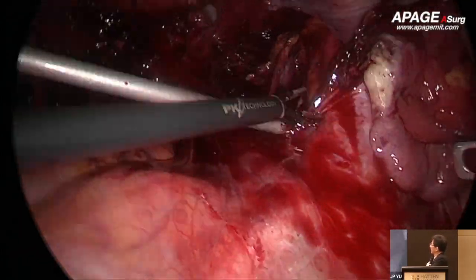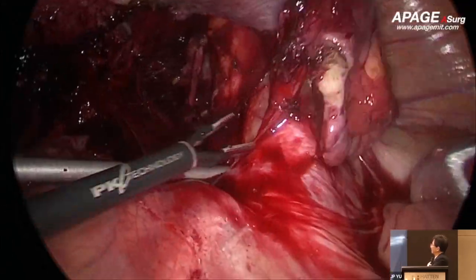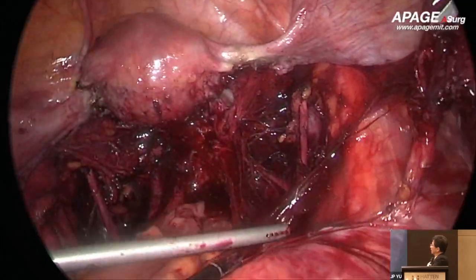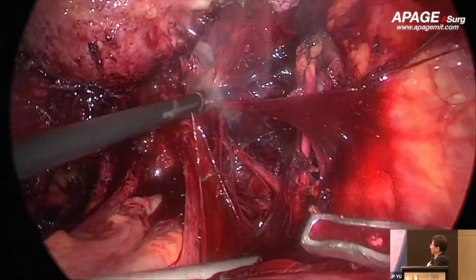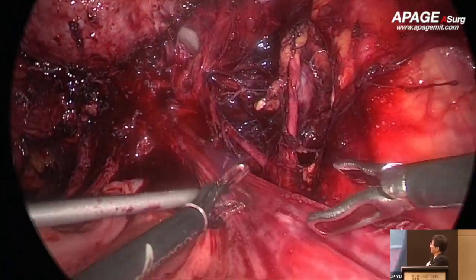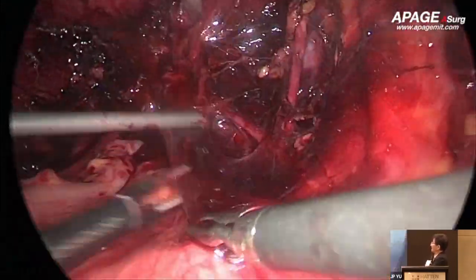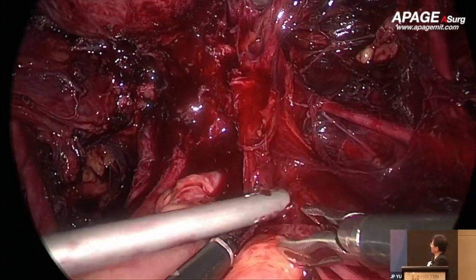So they have contact bleeding, or even when you dissect the space, it is very easy to get bleeding when you're doing the surgery. Okay, so that is quite different. So it's not always bloodless when doing the surgery. So there is another approach, HIFU surgery, you know.